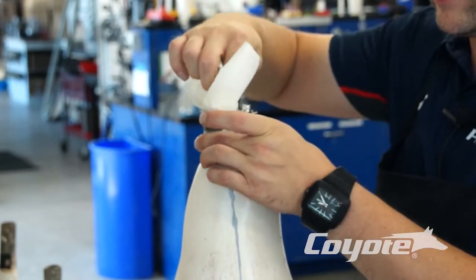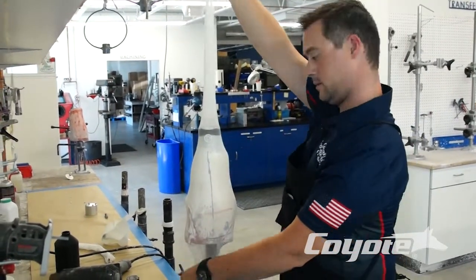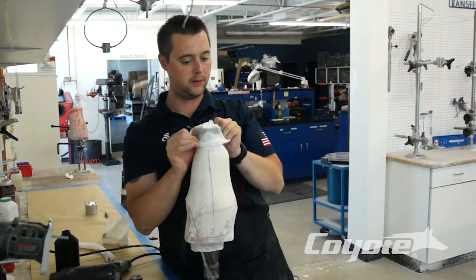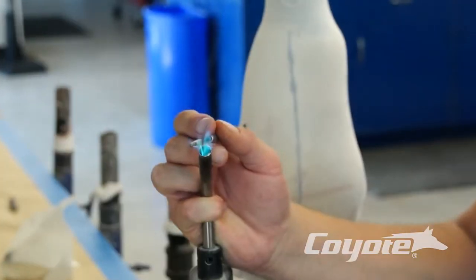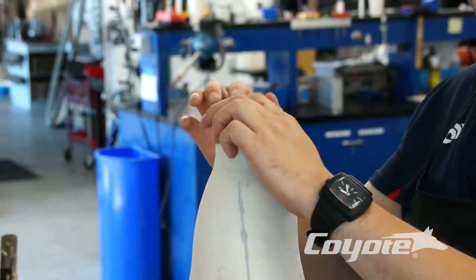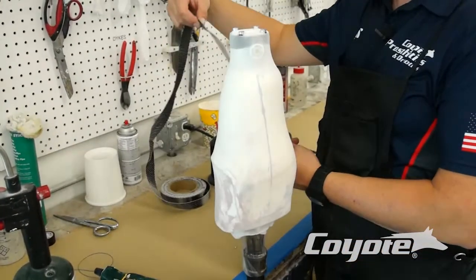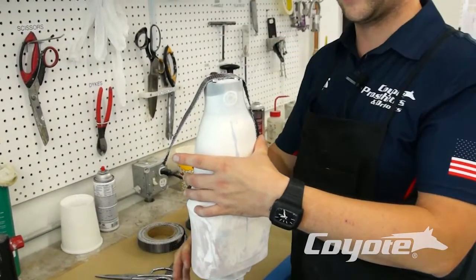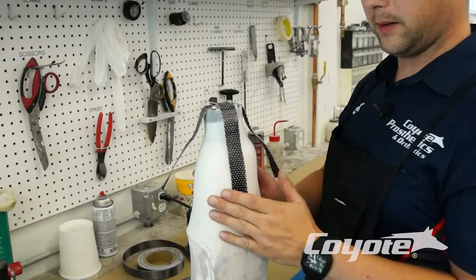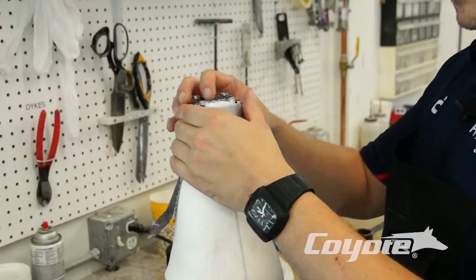Put a little acetone on the rag and clean up that excess clay. I start with just one sheer vacuum nylon — put one of those over top and tie and reflect it to the proximal edge, give it a little twist. You can also thread it if you want. When we're doing our test socket we want to expose these four holes so we can access them when we put our glue plate on and our four screws when we get ready to laminate. Now we've got our nylon on there — go ahead and get some carbon tape. Typically this is a secondary insurance just on the distal end over our fabrication dummy. I'll go ahead and lay two of these over ML and AP. We have plenty of length — we don't need to go all the way to the proximal edge. So I'll take these strips and spray glue those.